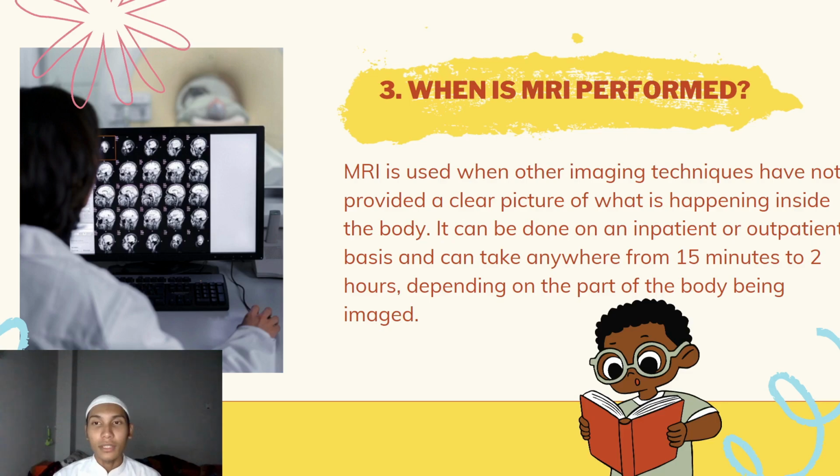Therefore, it is more often for doctors to use MRI for knee and shoulder injury. It can be done on an inpatient or outpatient basis and can take anywhere from 15 minutes to 2 hours depending on the part of the body being imaged. Inpatient involves overnight staying in medical facilities, while outpatient, on the other hand, does not require overnight stays, but the doctors allow the patient to return home after receiving the necessary medical services.